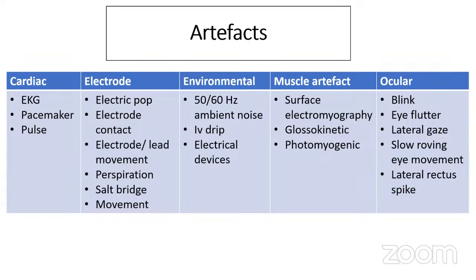But this is not a feasible thing when we are doing a routine 30 minutes of OPD recording. So even in that case, if we have a beautifully annotated record, where the technician keeps putting annotations as to here the child was sucking, here the child was blinking, here the child was being patted by the mother or was being swayed sideways, these annotations are very helpful in recognizing and labeling something as artifact if we are not able to identify those artifacts just by looking at them.